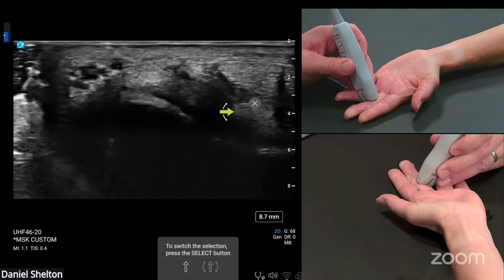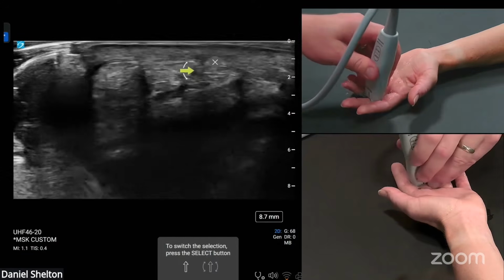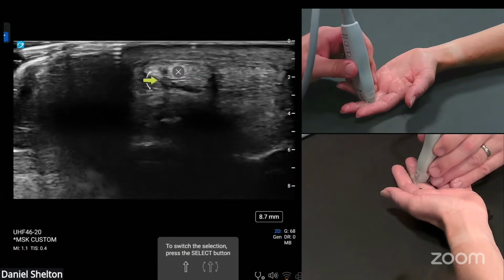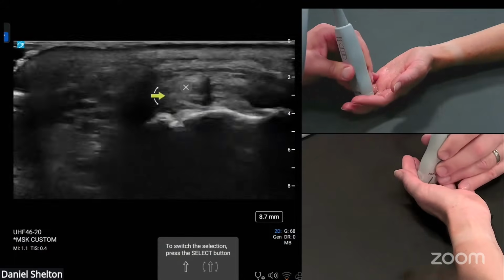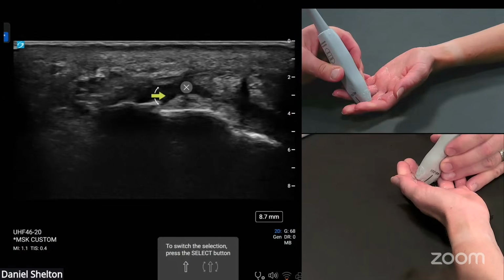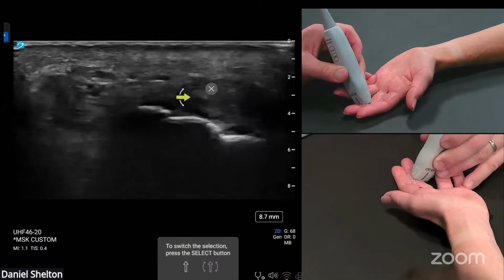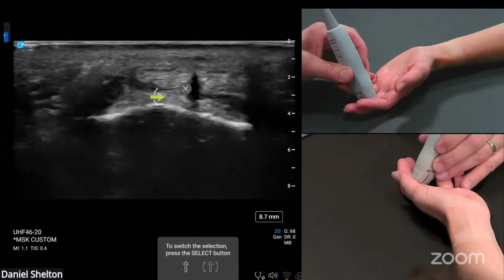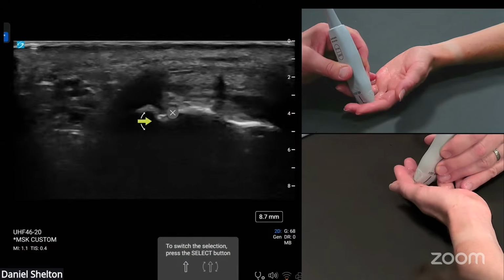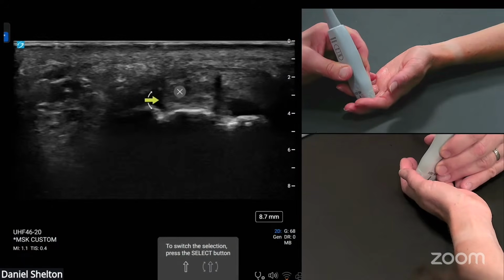So this is palmar plate. This is superficialis here. This is profundus. We can follow profundus up and over to the other superficialis, which is this other little corner. And then let's follow a superficialis to its termination or enthesis right here. There. You can actually see it inserting right there. There's this big long ridge on the middle phalanx that goes down the shaft of the middle phalanx. And that big ridge, which can often be mistaken for a step-off deformity or a fracture, is just a long tubercle for the insertion of the superficialis.